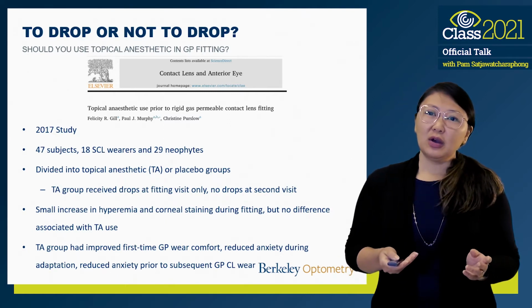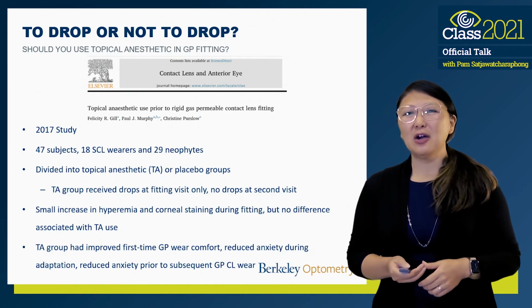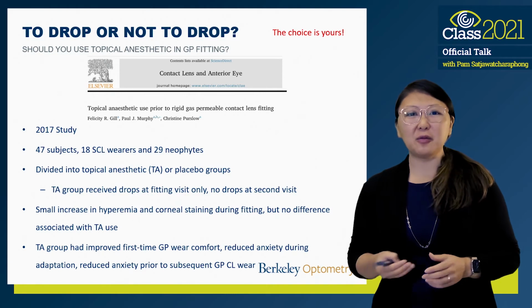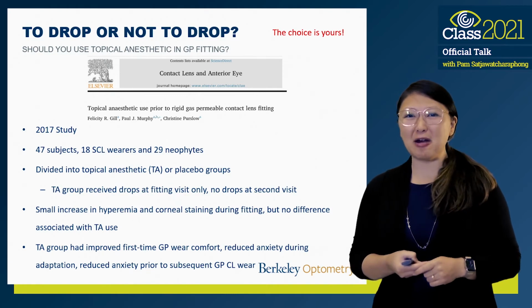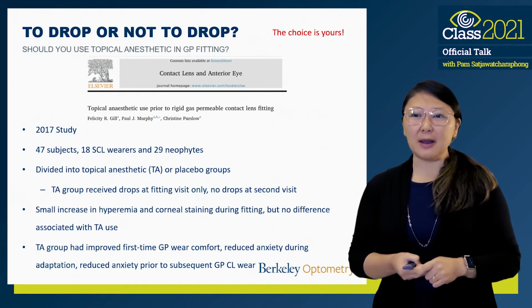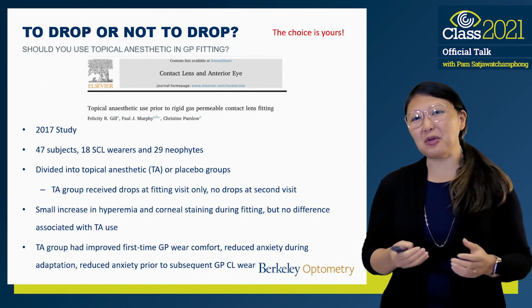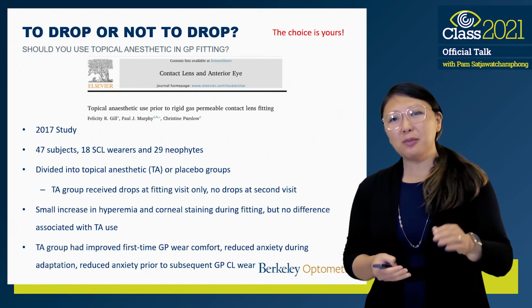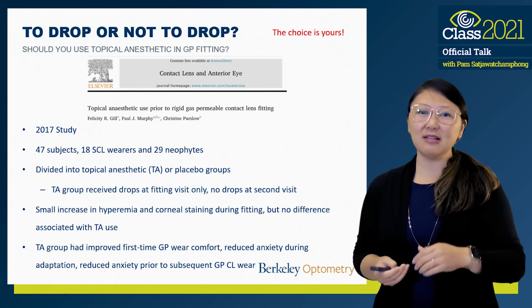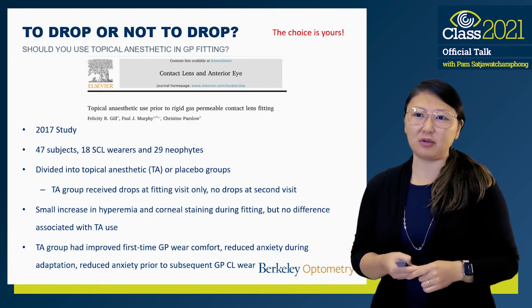So are you going to give your patient a false sense of security when you use anesthetic, or are you going to help them in the long run? I would say that there's still some back and forth amongst my GP colleagues as to whether or not to use anesthetic. I would say the choice is yours. One of my colleagues has a procedure where I think it's a nice way to introduce it. She'll put the GP on first without anesthetic and tell the patient, this is the worst it's ever going to feel. You know, this is the beginning of the adaptation process.